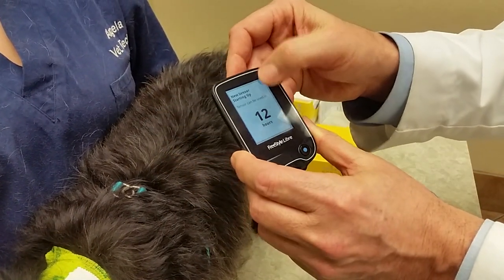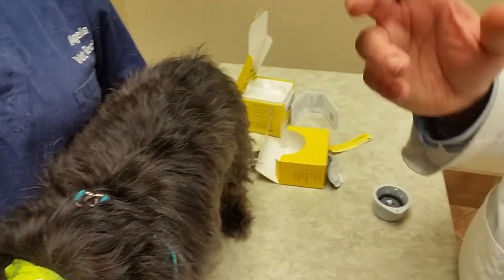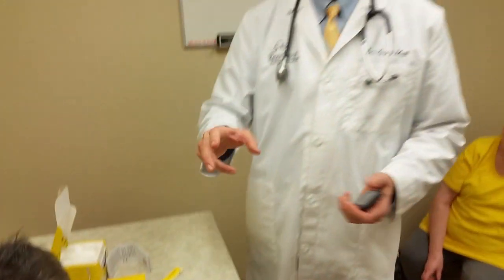So I just have to wait 12 hours. This is measuring interstitial fluid glucose — it's not measuring blood glucose. The interstitial fluid has a lag of about 15 minutes from what you're seeing with circulating blood, so if blood sugar goes up quickly, you've got about 15 minutes before your reader is going to show it.